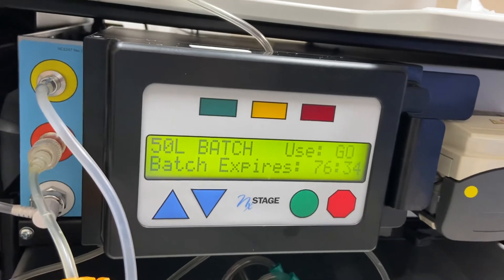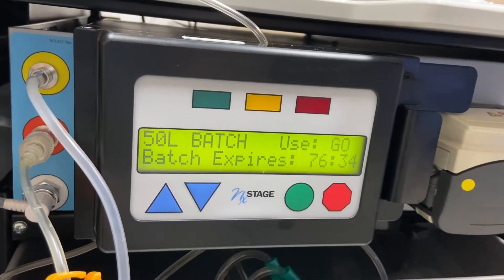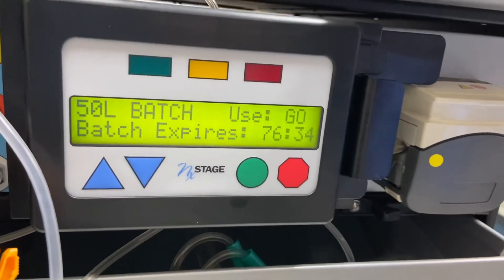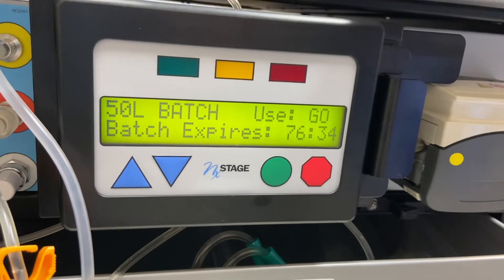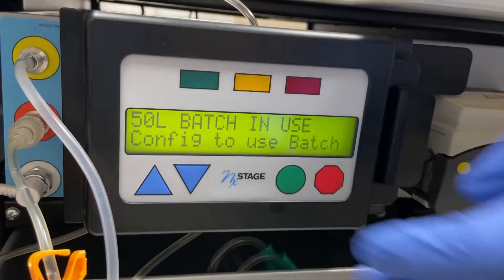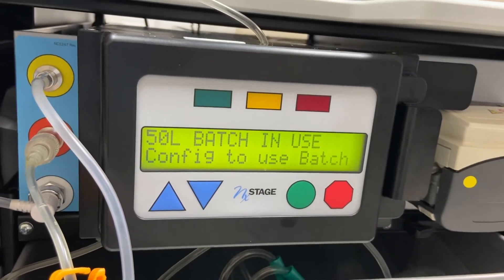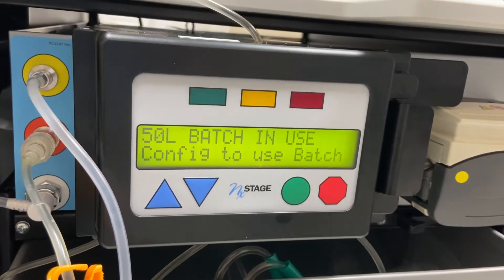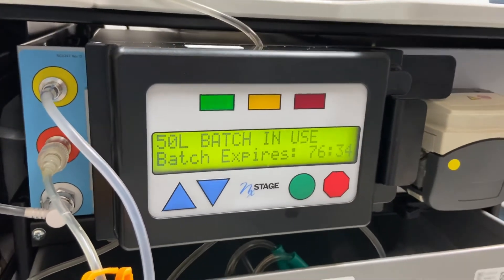50 liter batch. Batch expires 76 hours and 34 minutes. We want to use the batch, so we'll hit go. The green is blinking. Hit one more time, Anthony. And now this batch is ready for use.